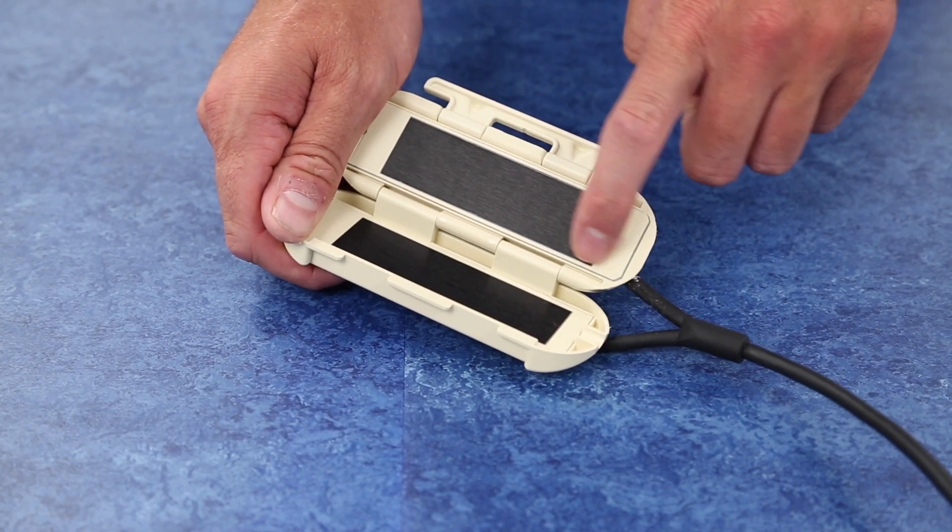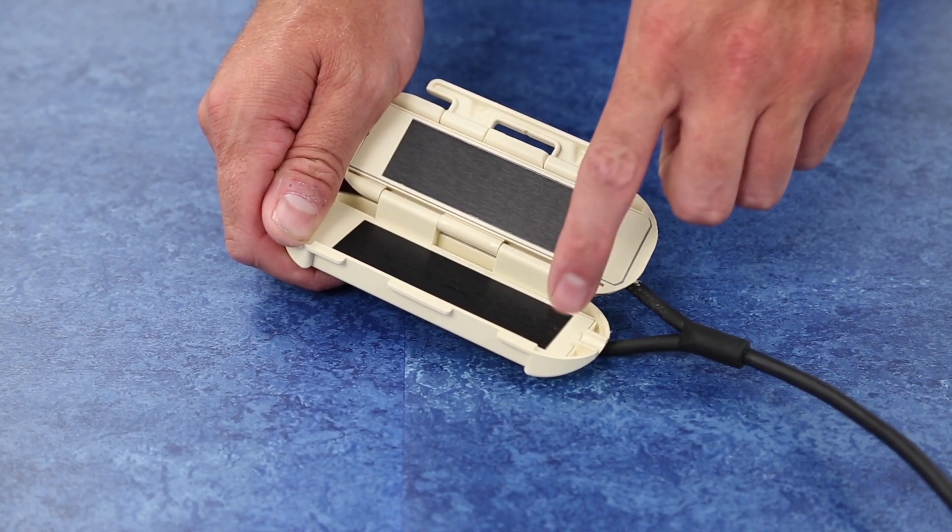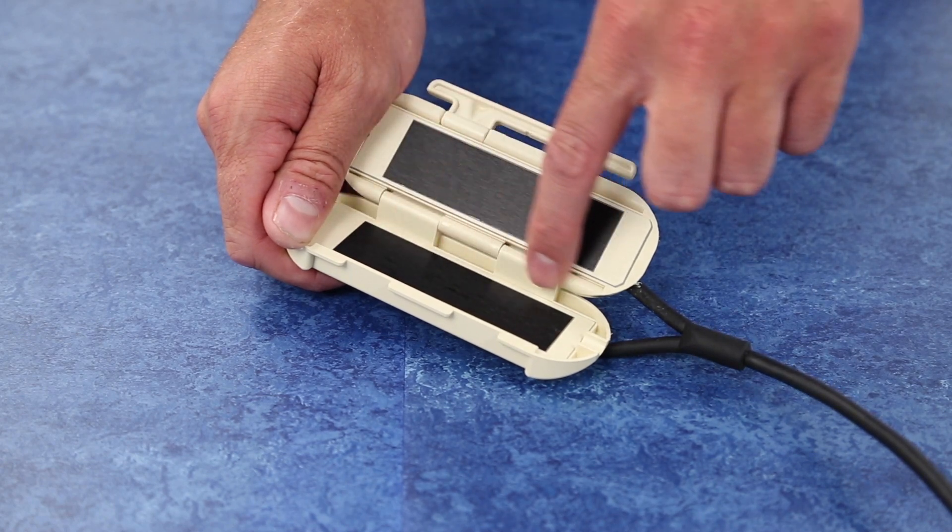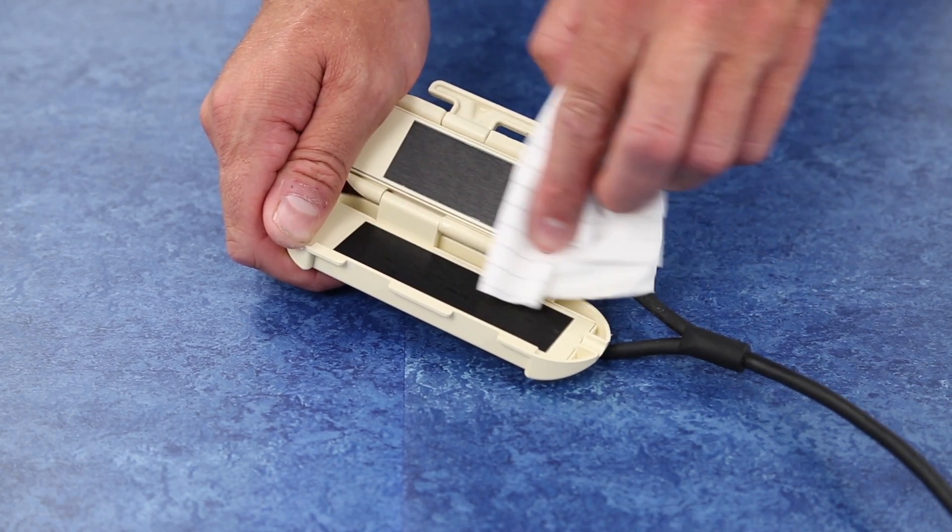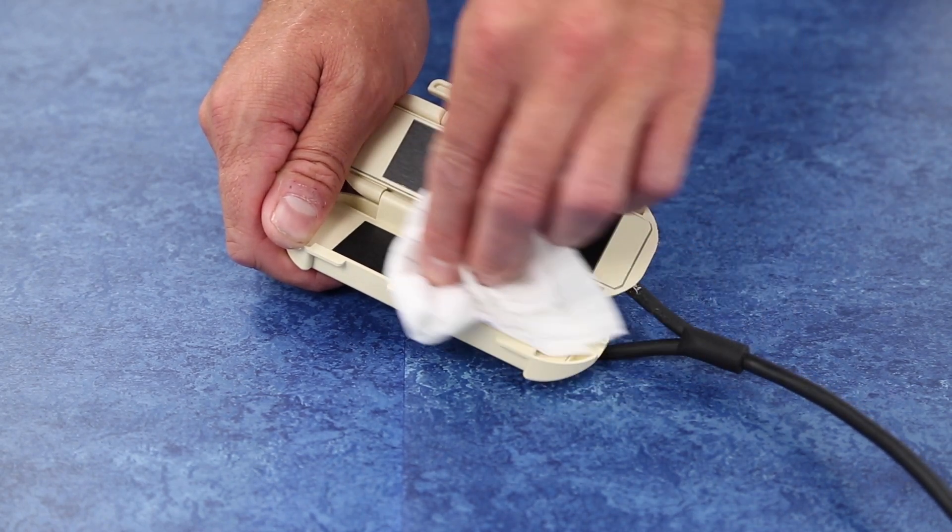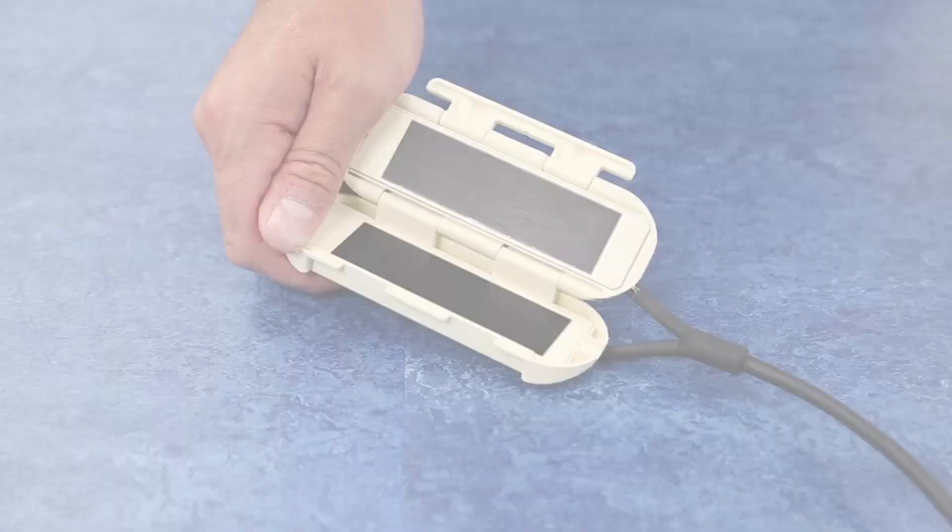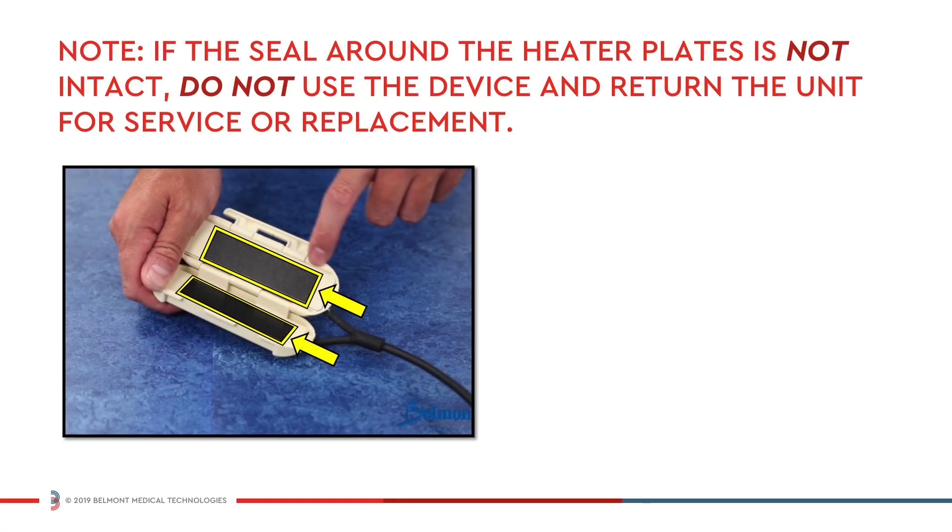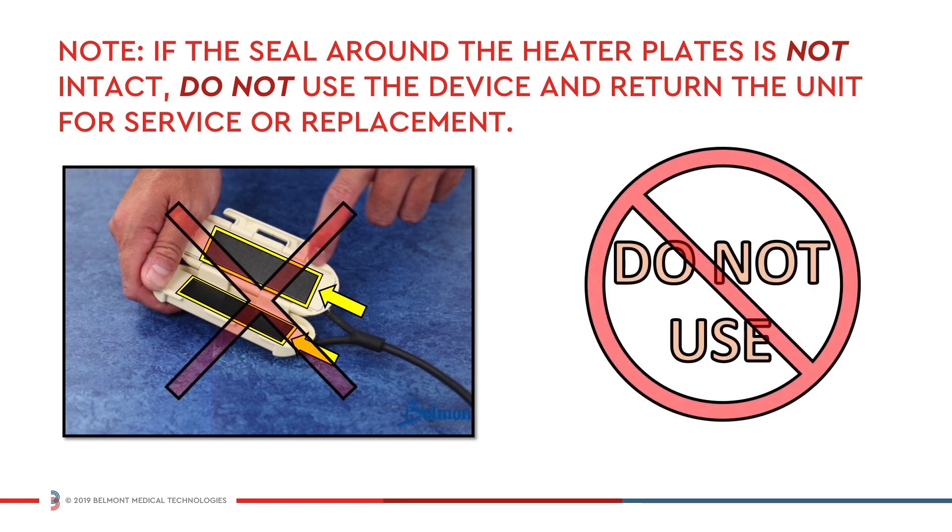Open the heater unit and inspect the seal around the heater plates. If the seal is intact, wipe the heater plates with a 10% bleach solution and then dry completely. Note, if the seal around the heater plates is not intact, do not use the device and return the unit for service or replacement.